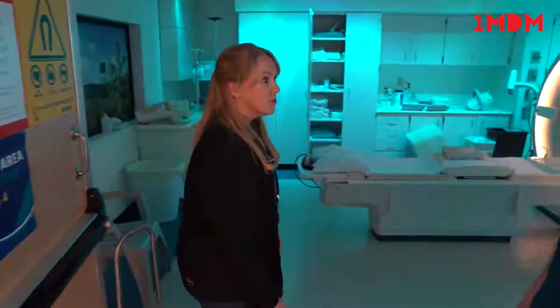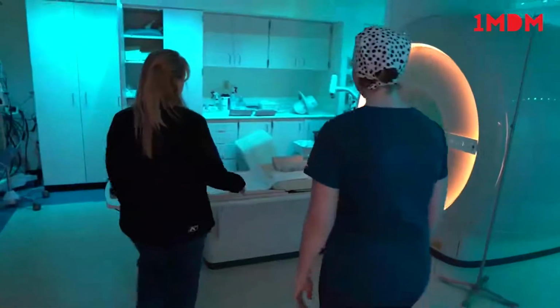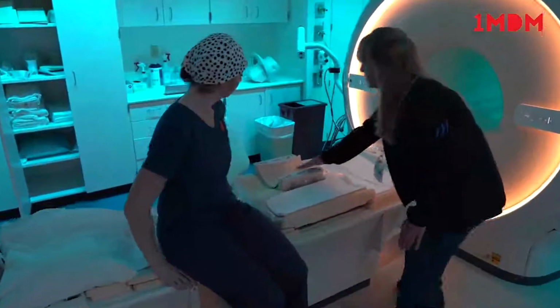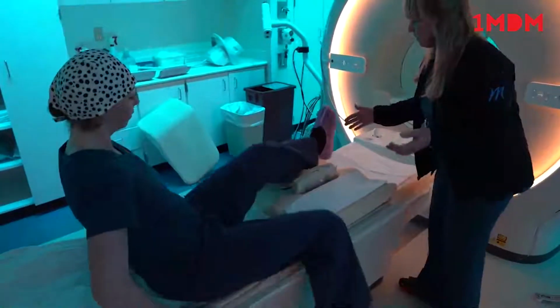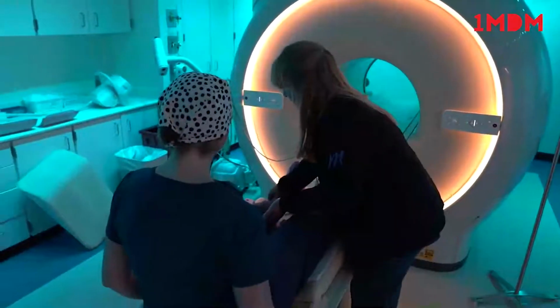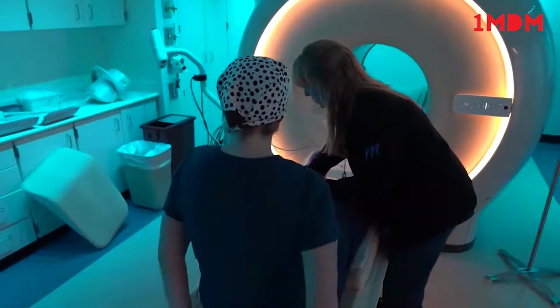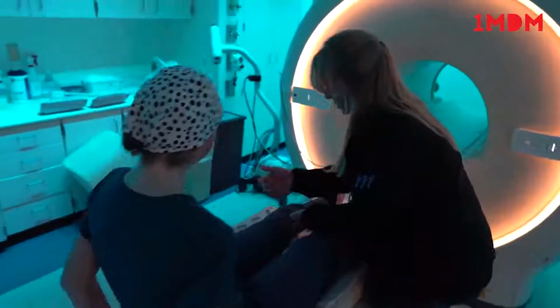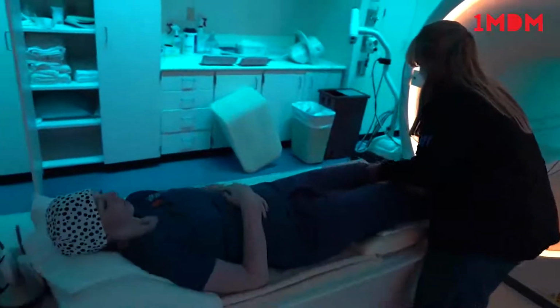So today we're going to do your left knee. I'm going to have you come over to the table. I'm going to have you sit down about right there for me. Your left knee is going to go into the center of this coil for me. Bring your other leg up onto the table. So we just want your kneecap right into the center there. So slide down a little bit towards your toes, a little bit more. And then when you lay back, you're going to slide that way. So perfect, okay. So your knee's right there.